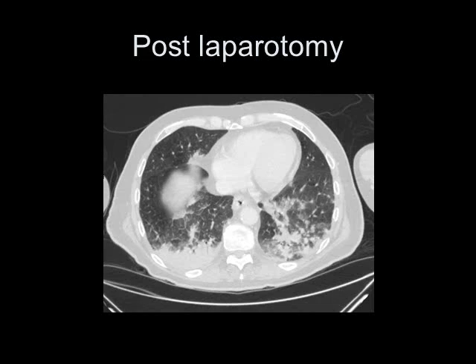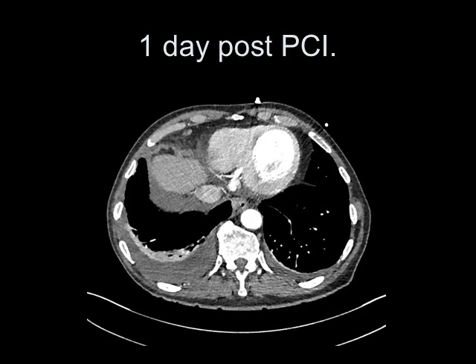Here's another patient post-laparotomy. I believe their scans demonstrate two contrasting processes. At the right base I would probably call this atelectasis — it's not particularly easy, but that's most likely. This area of irregular opacification I think is more likely consolidation; I certainly wouldn't call that atelectasis. Aspiration is a possible cause in that setting, so I would report this as probable consolidation and that other area as probable atelectatic change.